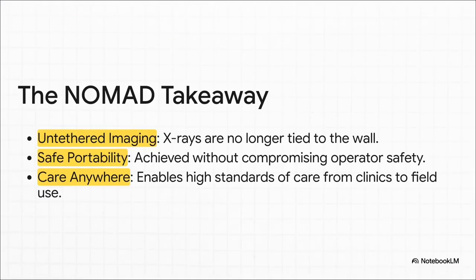It means X-ray imaging is finally officially untethered from the wall. It means we can have this incredible portability without compromising safety. In fact, you could argue it enhances it. And ultimately, it means that the highest standard of dental care can be delivered absolutely anywhere, whether it's a high-tech clinic in the city, a remote village, or even a disaster relief site.